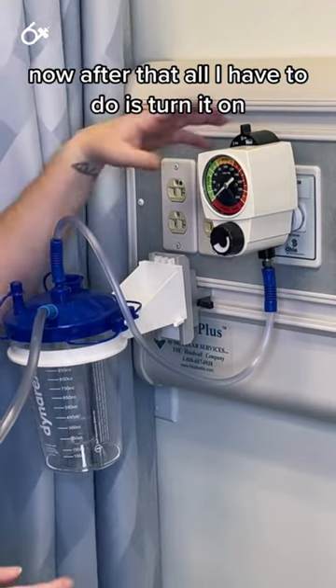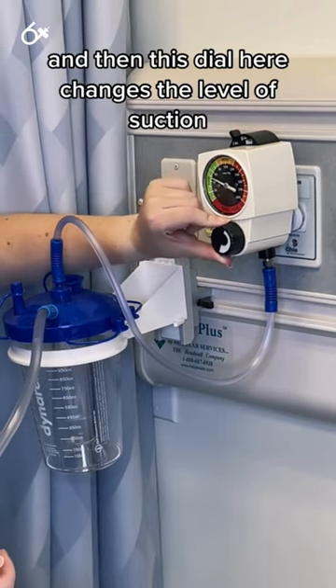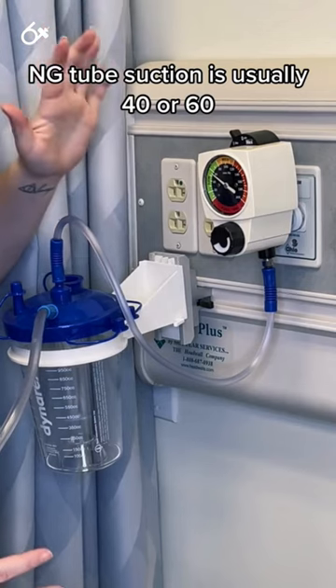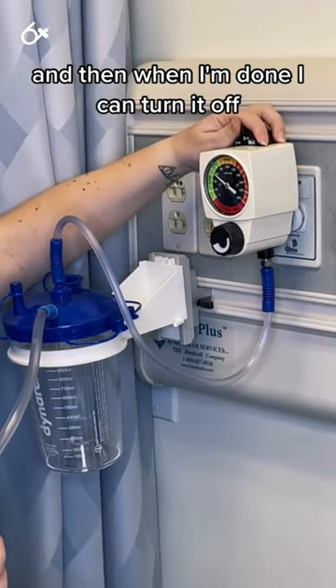After that all I have to do is turn it on. I just turn it on and this dial here changes the level of suction. NG tube suction is usually 40 or 60, sometimes 80, but it is always fairly low. When I'm done I can turn it off.